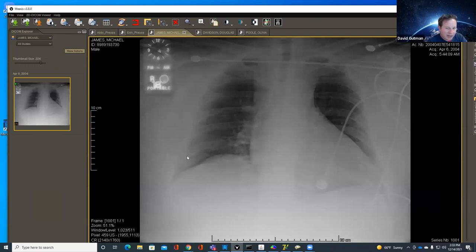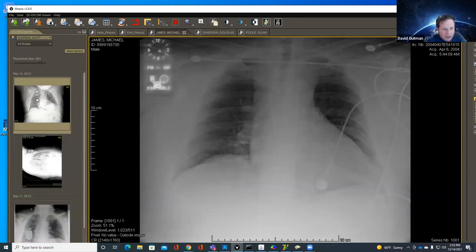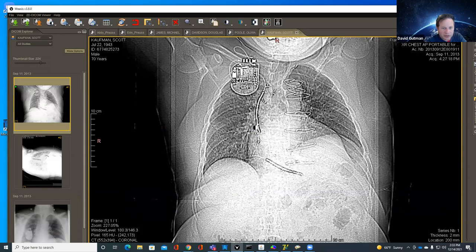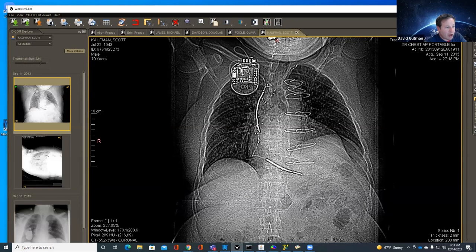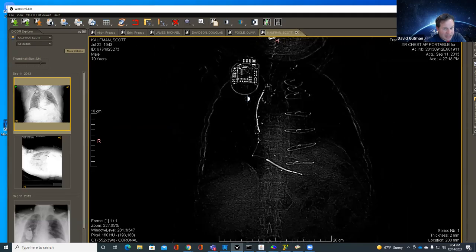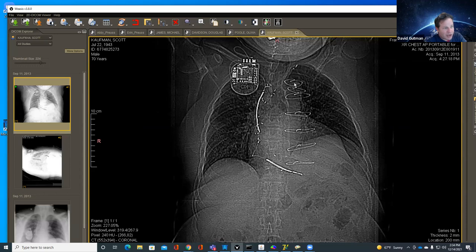A couple of things I wanted to highlight: brain imaging and X-rays aren't necessarily the data most of us will be looking at, but what I wanted to highlight is that you can imagine someone with a deep brain stimulator or some other implanted device. It's possible you could read the serial number off the actual device itself. Even though you wouldn't necessarily say there's burnt-in PHI, if you play around with the contrast, it's possible for some devices you may be able to read some sort of registration number.